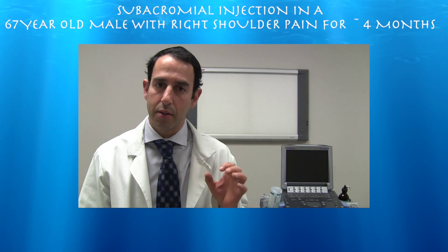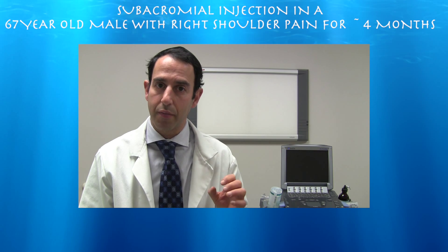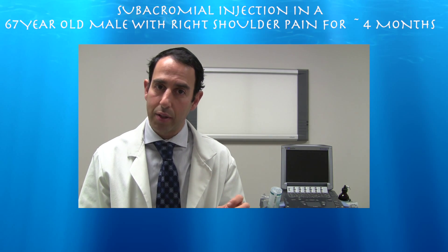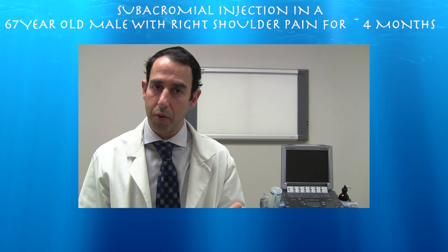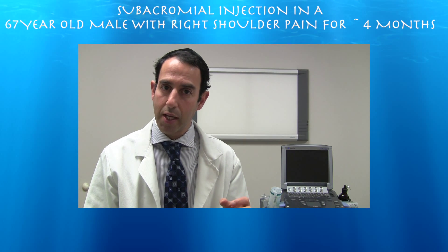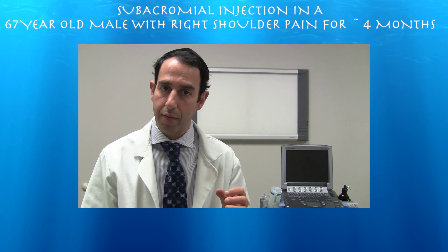Here is a routine subdeltoid injection in a 67-year-old male. We feed the needle right under the deltoid muscle into the subdeltoid bursa, which looks basically like a little thin black line. Once you start injecting this region, you can see how it fills up with fluid and you have this whole space.